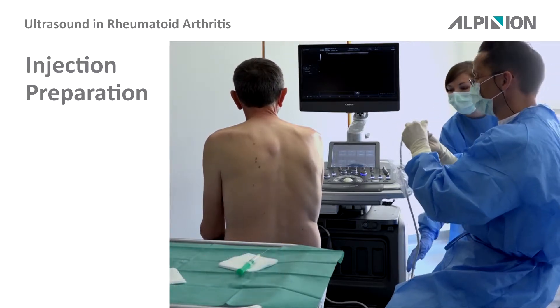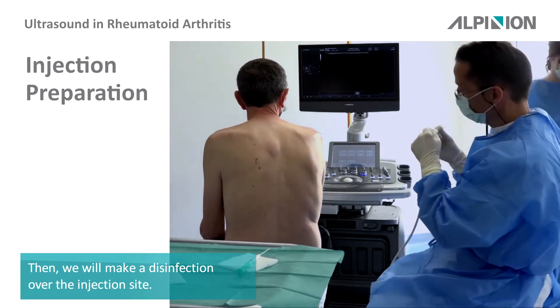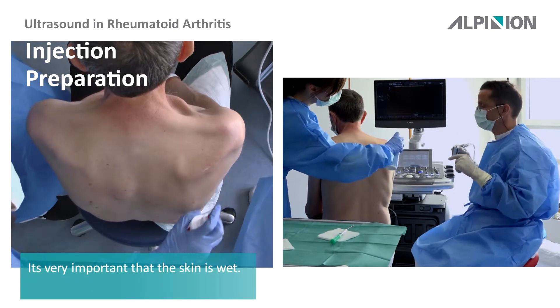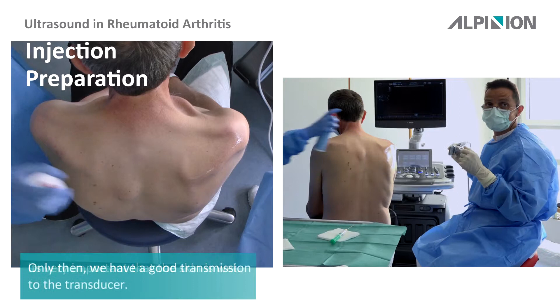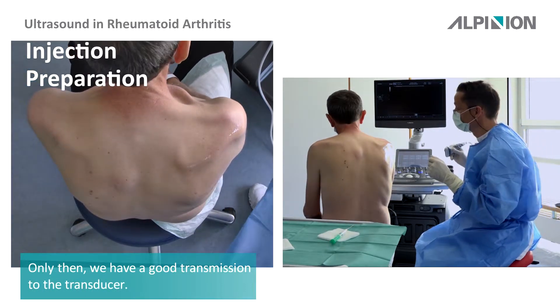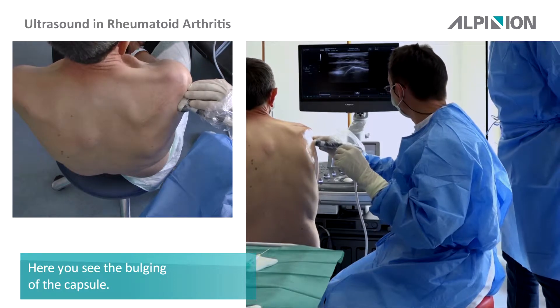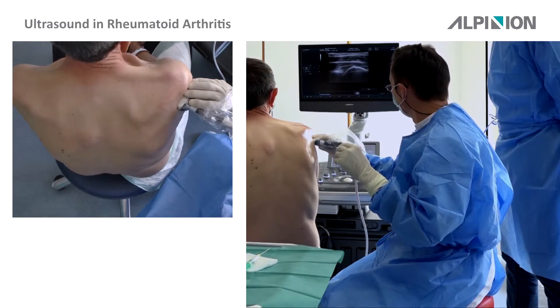Once again we will make a disinfection of the injection site. It is very important that the skin is wet so that we have a very good connection to the transducer. Here you can see the bulging of the capsule.